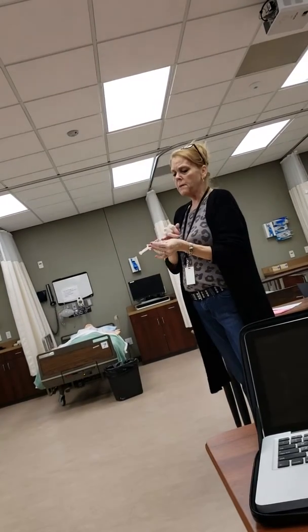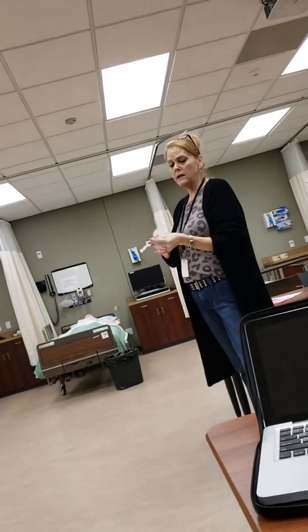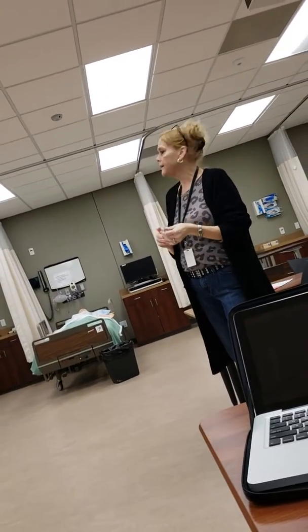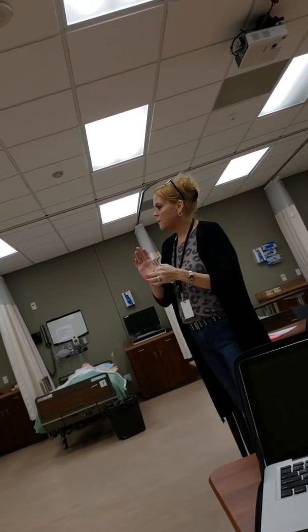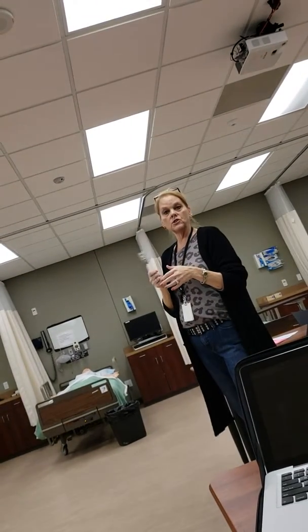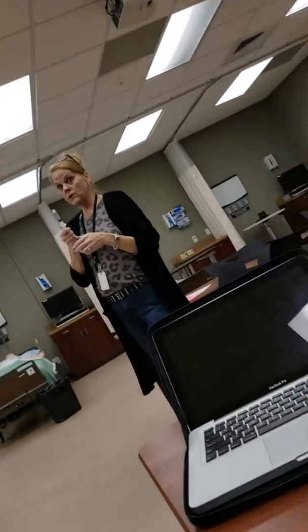Once you get about, if you're going to do a whole 10, if you're anal like myself and you're going to give them the whole 10, do 5 at the same rate and then just slowly push the rest. You just don't want to give that patient a bolus of whatever medication you just gave with the flush. Questions? Are we good so far?